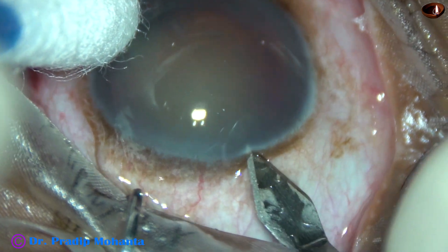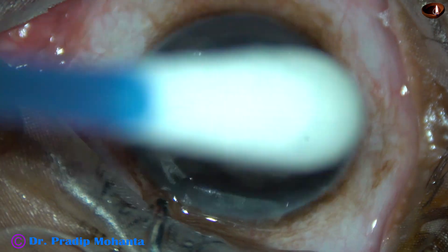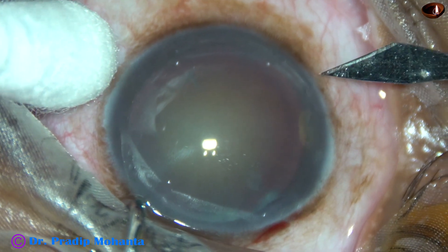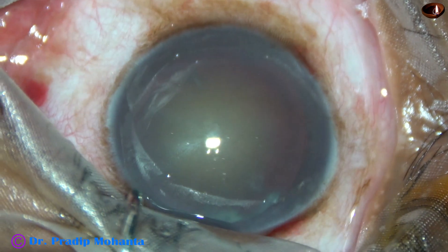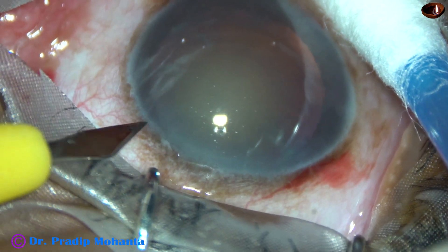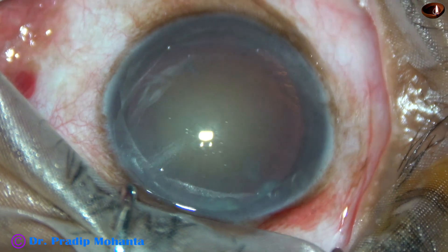This is the main incision with a 2.8 mm steel keratome. This is a side port on the right side of the main incision, about 3 o'clock hours away. And this is another side port on the left side of the main incision, about the same distance away.